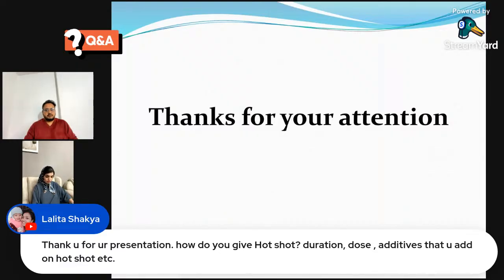Usually we give hot shot at a temperature of 34 to 37. That is enough. It flushes out all the residual potassium, and if needed we can add lignocaine (Xylocard), and sometimes a few drops of adrenaline to that.